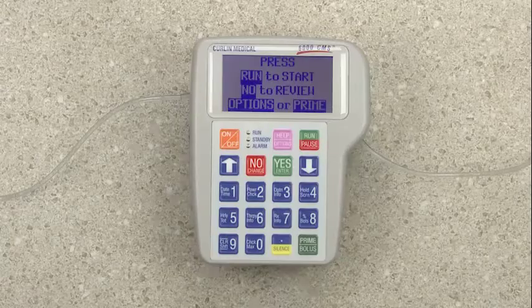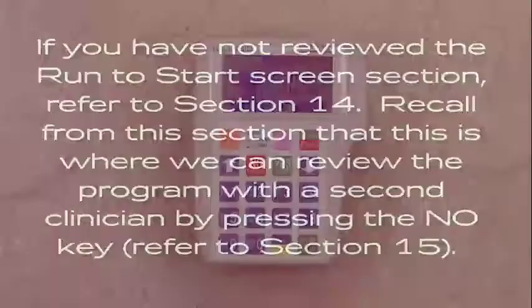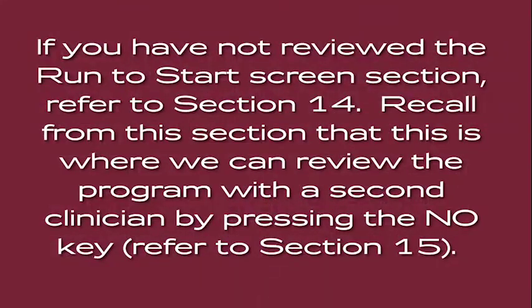At this point, we are at the run-to-start screen. If you have not reviewed the run-to-start screen section, refer to section 14. Recall from this section that this is where we can review the program with a second clinician by pressing the no key.